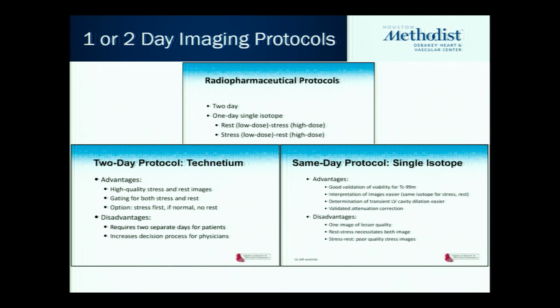So when it comes to protocols, we have either a one-day protocol or a two-day protocol. When do we choose which? In general, one-day protocols are used for those patients who you need to complete in one day. Those would be your outpatients or maybe your inpatients where decisions need to be made. The hospital is now held accountable to discharge in a timely manner. All of these things lead you towards one-day imaging.